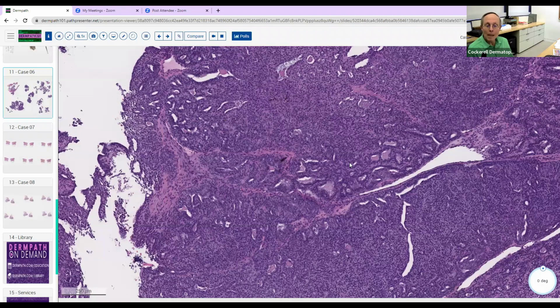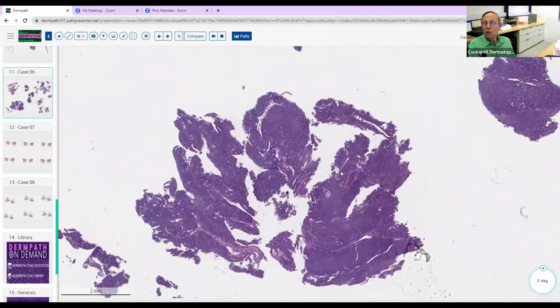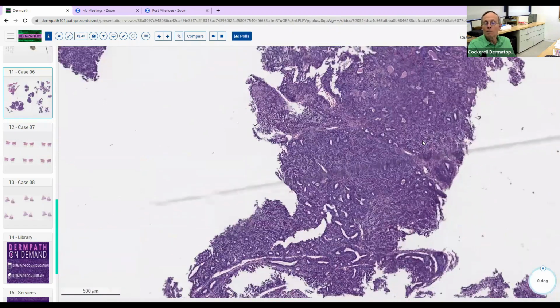This is aggressive digital papillary adenocarcinoma, and it's kind of a wolf in sheep's clothing, if you will, because you don't have to have a lot of atypical cells or a lot of mitoses. It's really diagnosed as malignant based on the asymmetry and the fact that it's often large, like you see here. Even though it's got a bland cytology, it metastasizes fairly commonly, and it can actually kill the patient. It can be fairly aggressive, even though it doesn't look all that atypical under the microscope. So it's a good lesson to learn. You're exactly right. That's exactly the way to work this up.